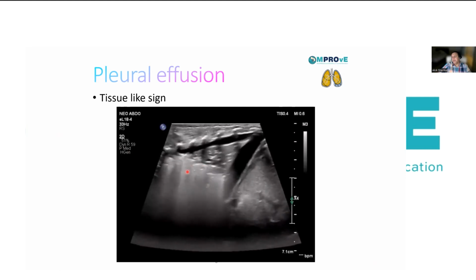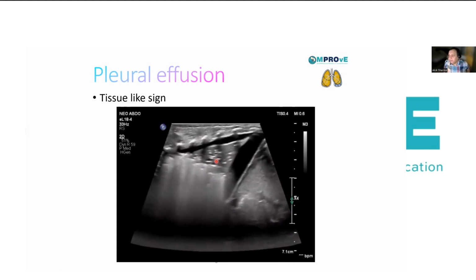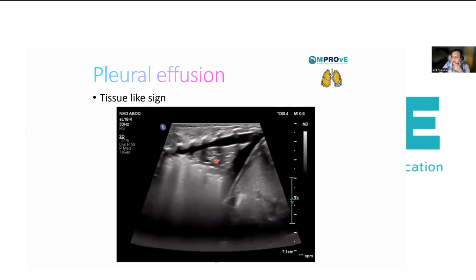Appear, disappear. These are dynamic bronchograms, air bronchograms. And these dark areas that you see in between, they're actually fluid bronchograms. Now, this is a baby who had previously had a chylothorax with a chest drain inserted, where we had started feeds, and there was accumulation of an effusion. But more importantly, from our perspective, this baby had started to get severe respiratory distress, had become febrile.